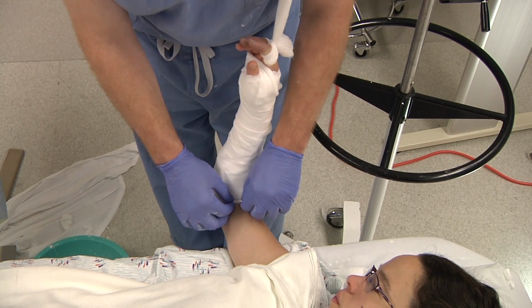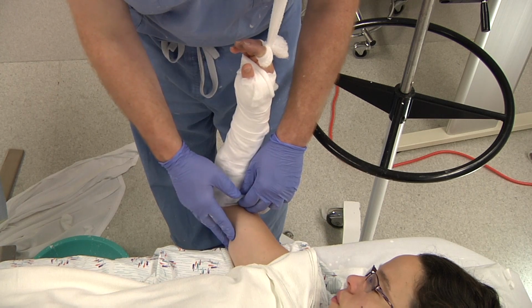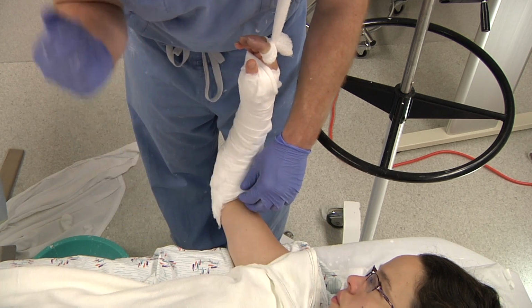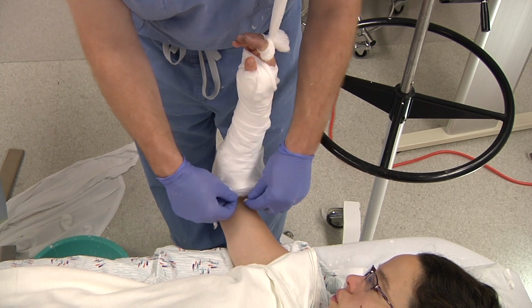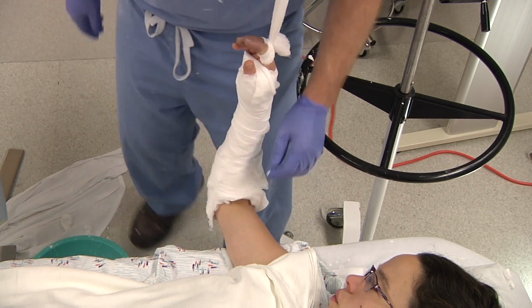Don't overpack the antecubital fossa, in somebody where you don't need to get stability of the elbow or rotational control. That can constrict there, and so make sure if you do have web roll in the antecubital fossa, you can easily pluck that away.